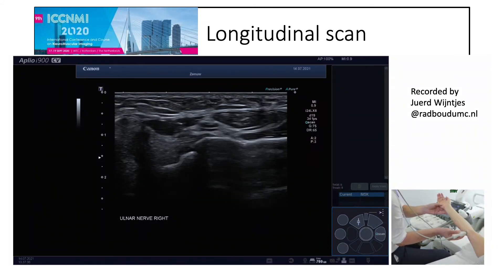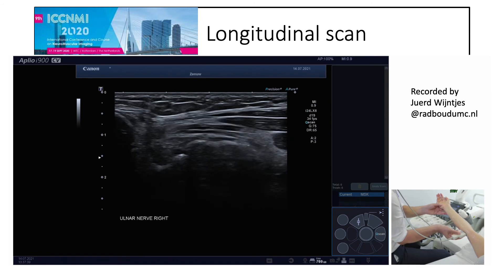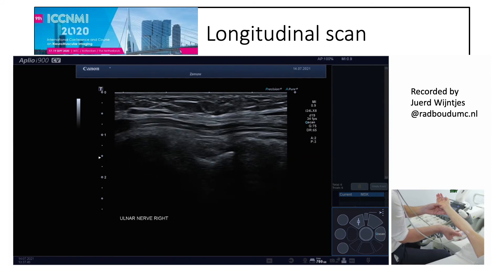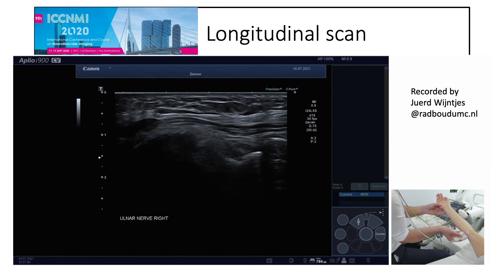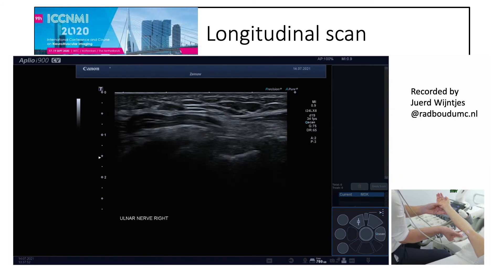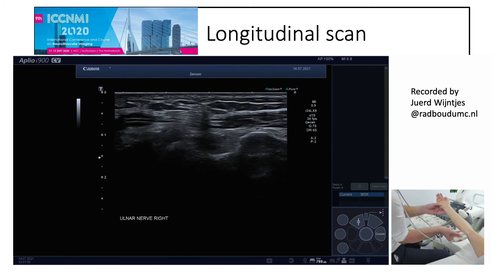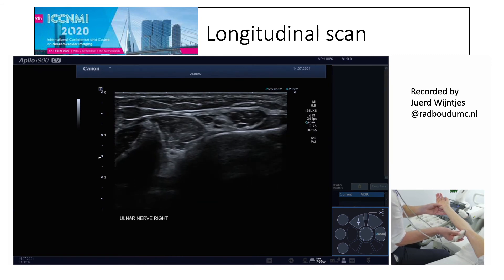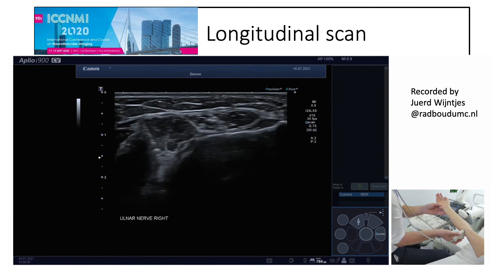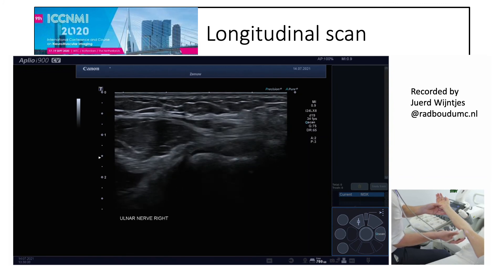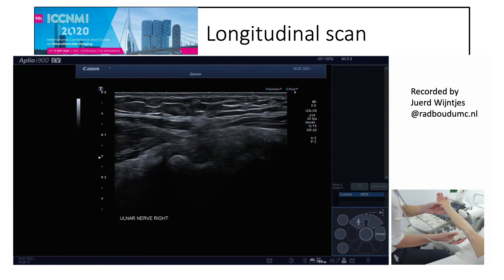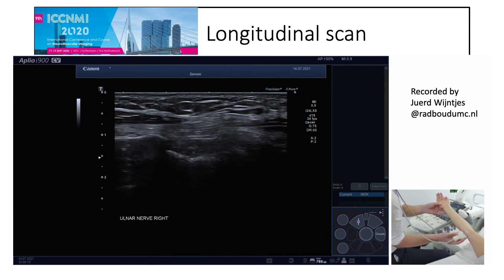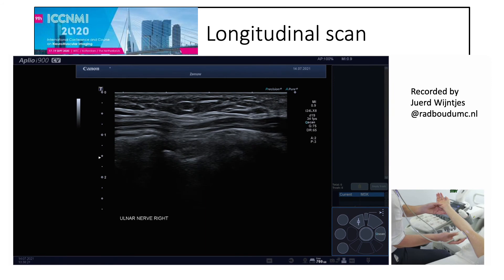It is also important to perform a longitudinal scan. When doing so, the patient must extend the elbow, otherwise it is not possible. Even so, it is sometimes quite difficult to show the whole ulnar nerve in longitudinal view because of the anatomical course it takes — though you can see it quite a little distal to the medial epicondyle, and the nerve will be shown longitudinally, even if it can be challenging.